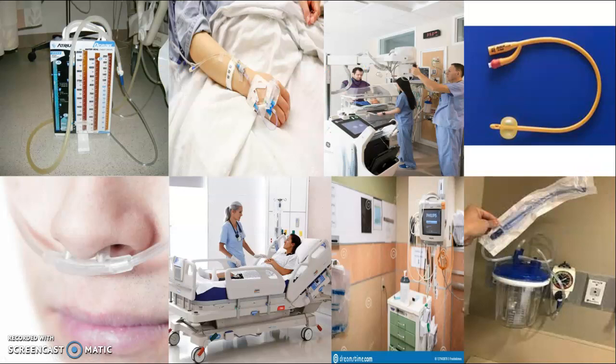So here's examples of all different things that we'll see. In the top left, we have the chest tube disposal, and then IVs, neonatal incubator beds, catheters, nasal cannulas for oxygen delivery, different types of hospital beds. Here's the vital signs monitoring that we have mostly in the ER, but also up in the inpatient beds, and also suction.